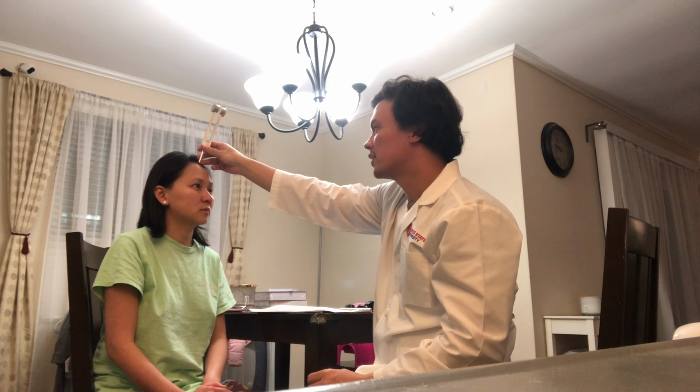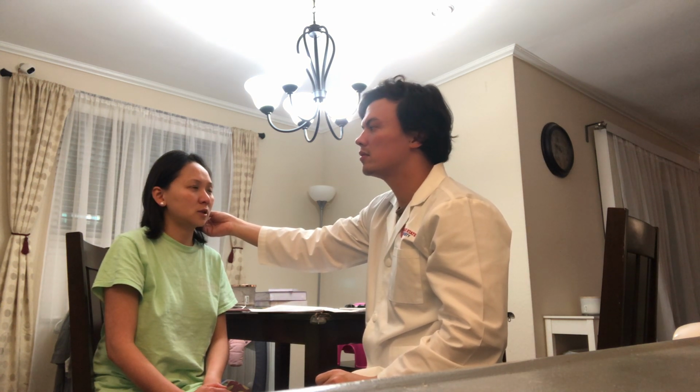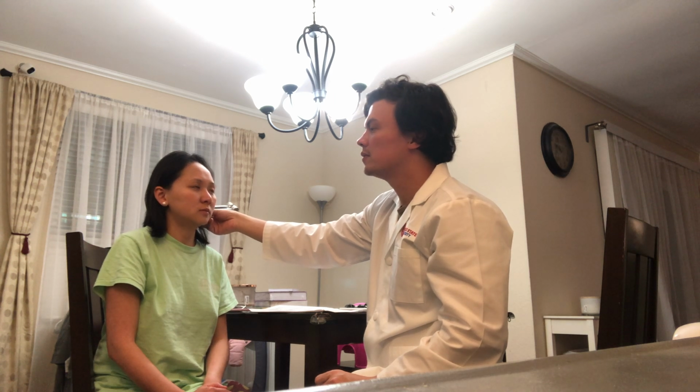Tell me when you can no longer hear it. No. Okay, and then you check for the Rinne test, the air and bone conduction. Can you hear it? Yes. Tell me when you can't hear it. Mm-hmm. Can you still hear it? Yes. And then you do the same on the other ear.